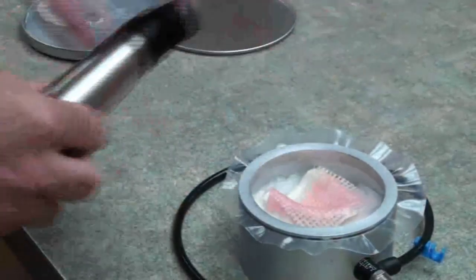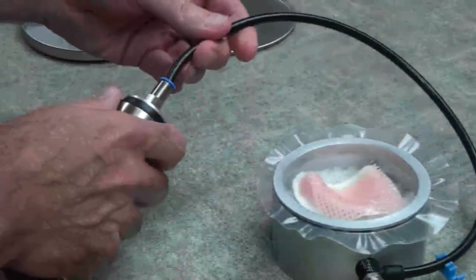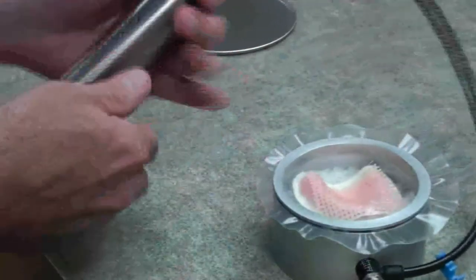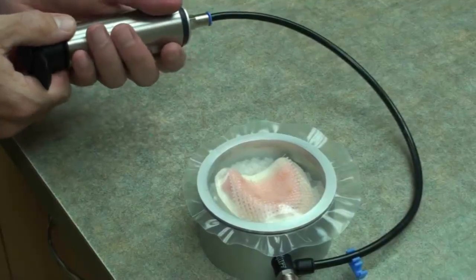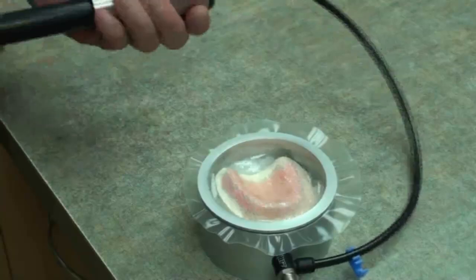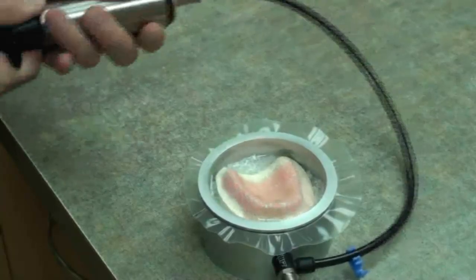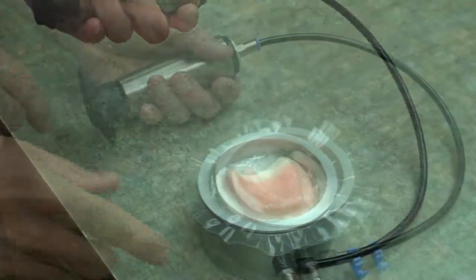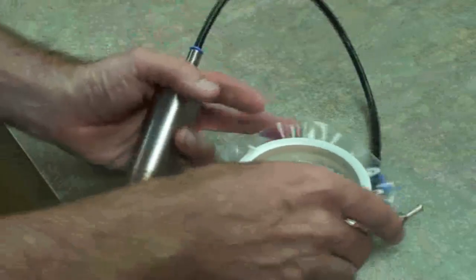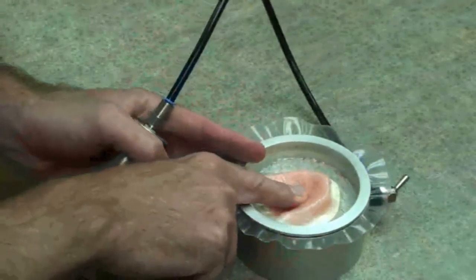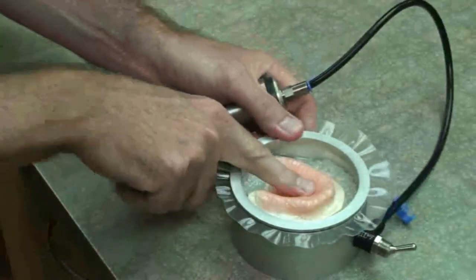Attach the manual hand pump to the tubing. Activate the pump to remove the air from the chamber and draw the gasket perfectly into place over the model.